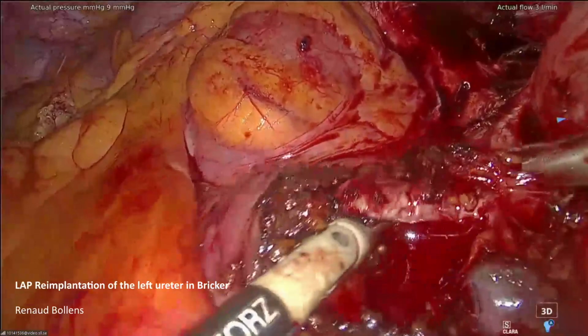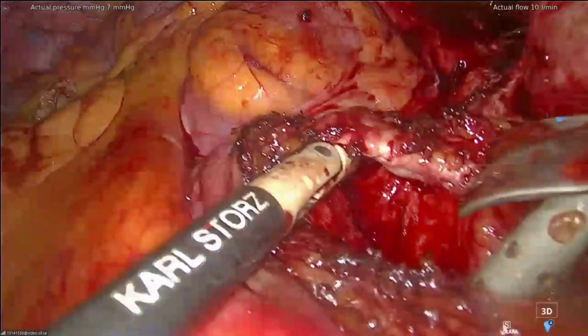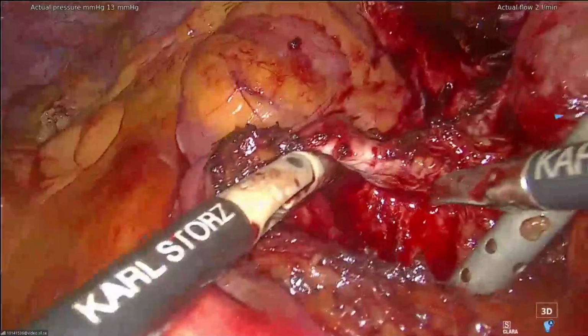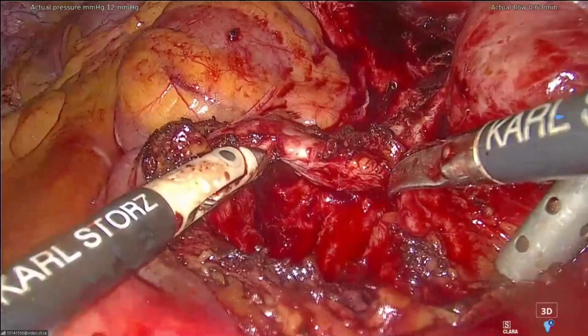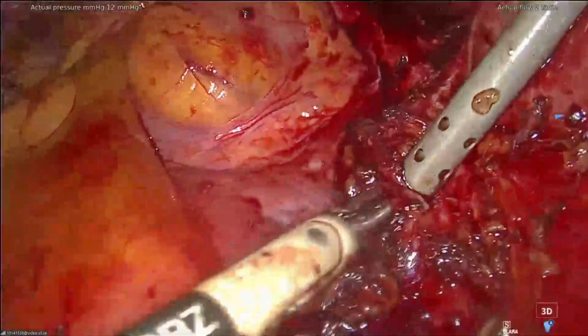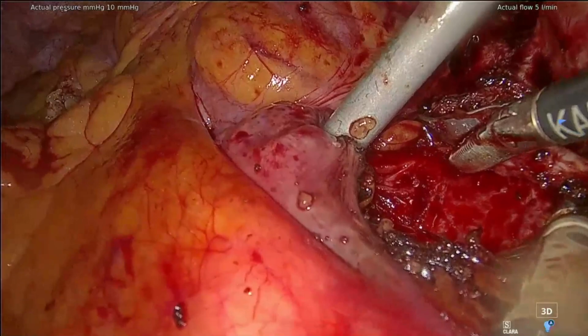Yeah, it's possible, yes. Suction down here. Okay, I arrived close to the Bricker. If I have to injure the other ureter, it's usually at this level. Yeah. Because you can have the two ureters really close, side by side, and then you cut the tissue, and you end up cutting the other ureter. But at least like that, in terms of oncologic risk, I will be able to remove all the distal ureter, and I think that is better. You are right, totally right.